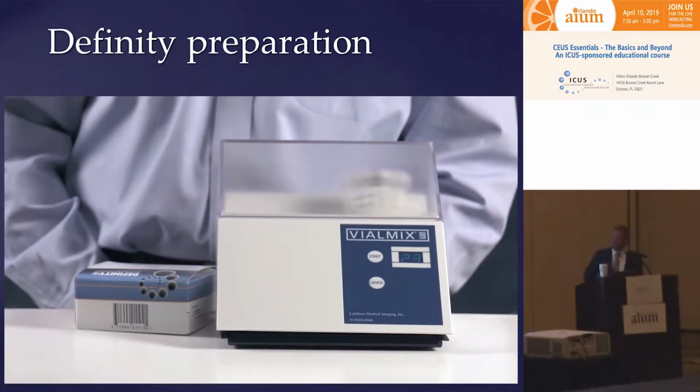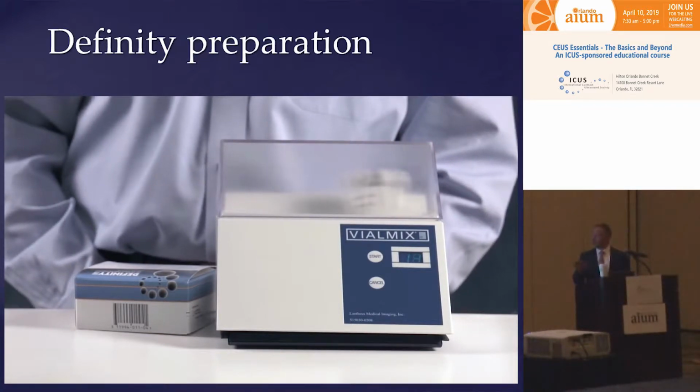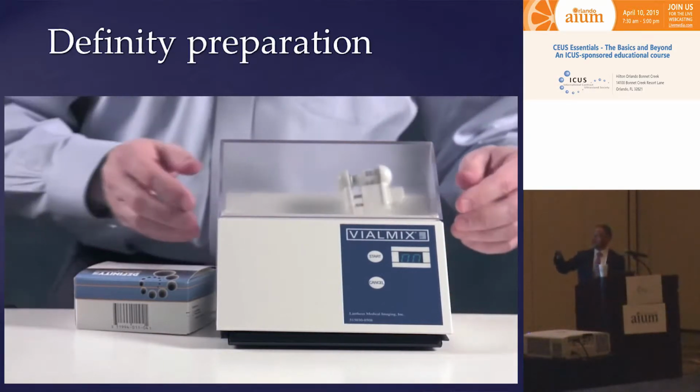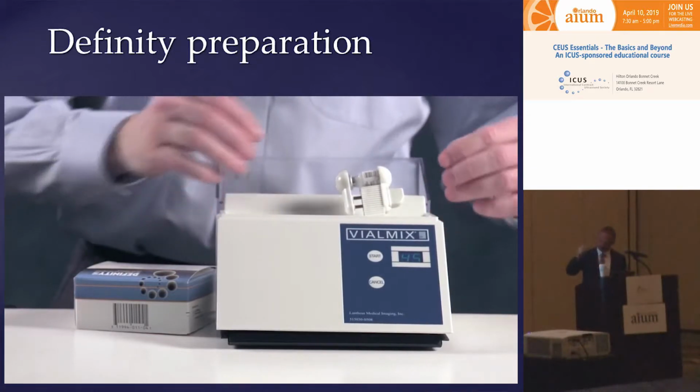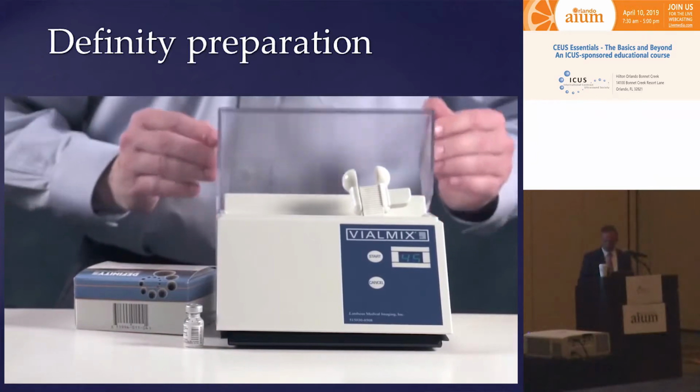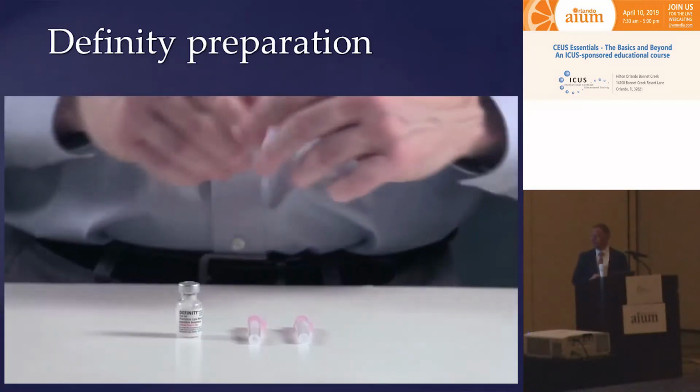We speed it up a little bit, so I'm not having seizure behind this, but 45 seconds after you start activating Definity, it will again turn into this milky substance, and you can use it for your contrast-enhanced ultrasound examinations.